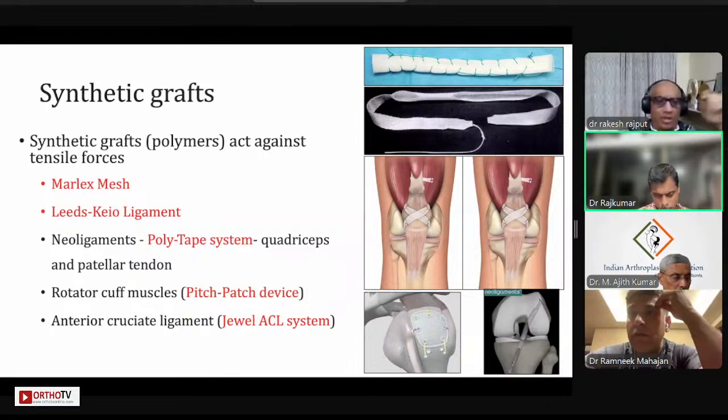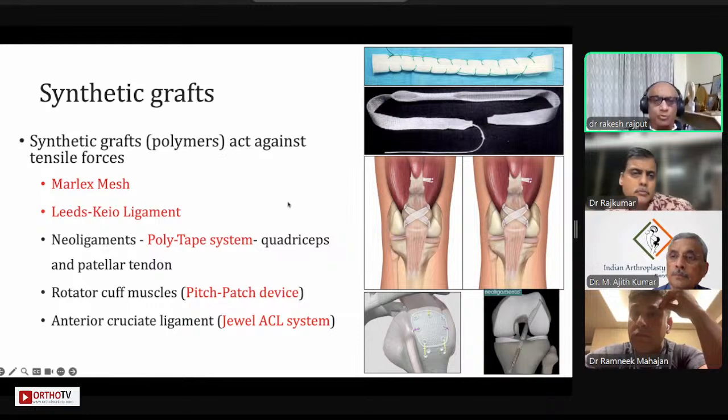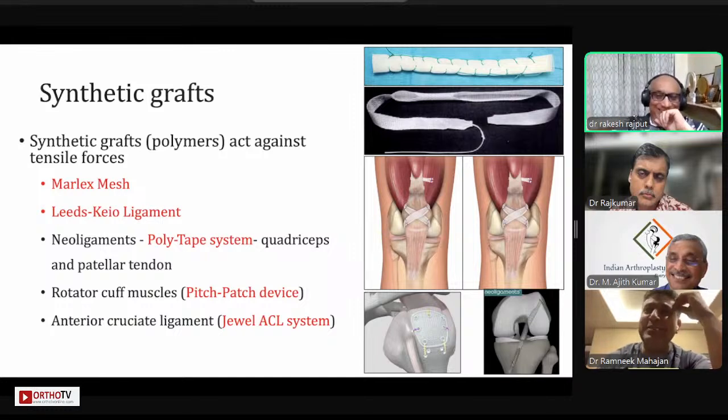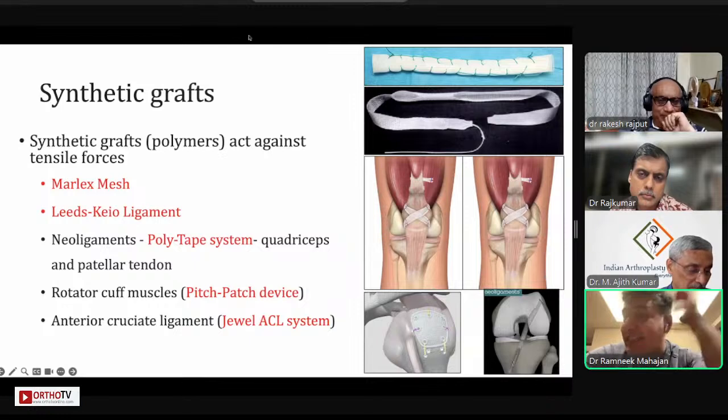Okay. Ramnik, a question. You seem to be seeing a lot of these. Do you think there's any way the Stryker implants are contributing to something like this? I've seen it in Smith and Nephew also. But I can probably tell you this, it's a high degree of suspicion.